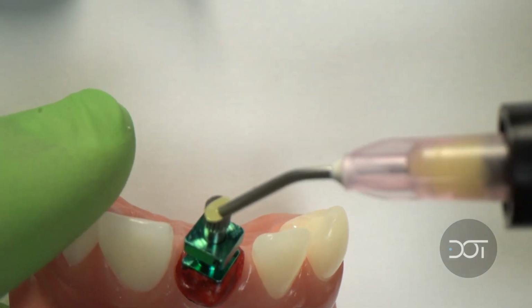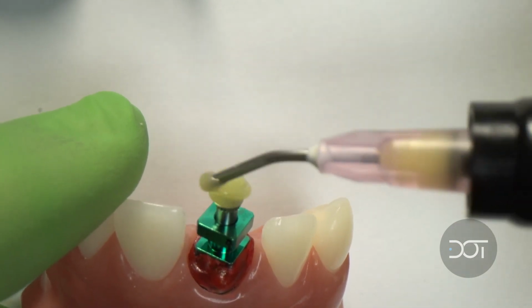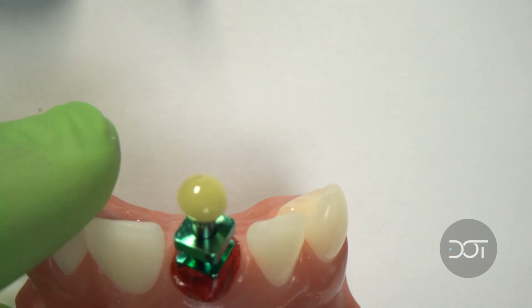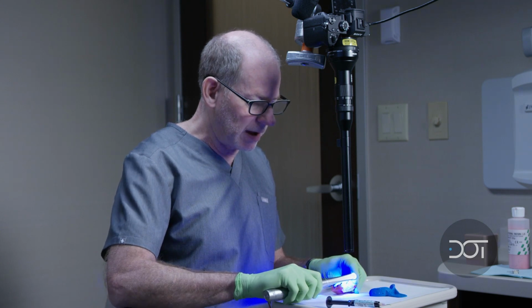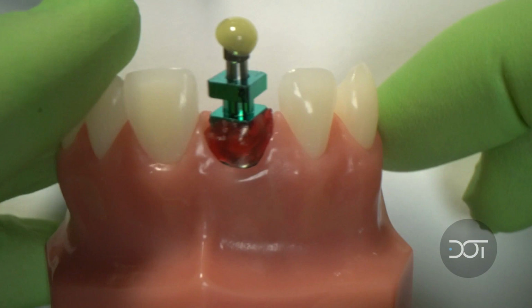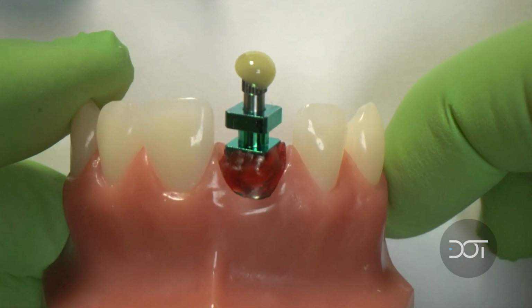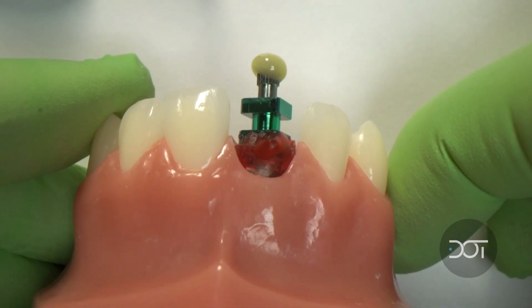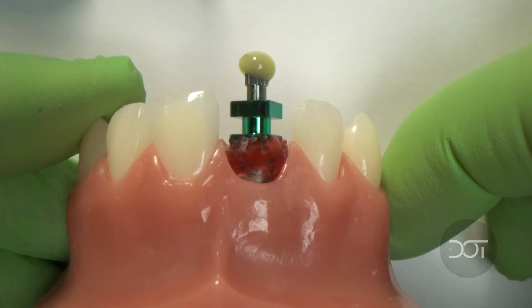All right, so I'm going to take this GingerGuard flexible composite, and I'm going to create almost like a large bead of the material over the screw head, something like that. This is light curable, so I'll light cure that for 10 seconds. Now it's nice, I have this little ball of flexible composite sitting over top of my pin, which again is going to make it easier for me to identify as I'm putting the impression tray into the mouth where that pin tip is. And then also it's going to be a nice clean area for me to go in with my driver and loosen the screw before I remove this from the patient's mouth. Now we're ready for impression.